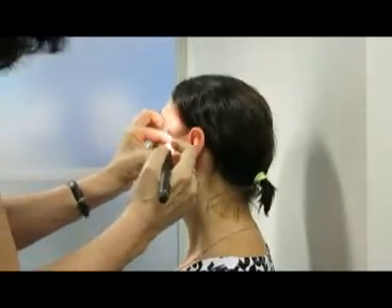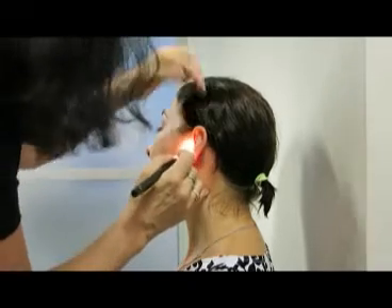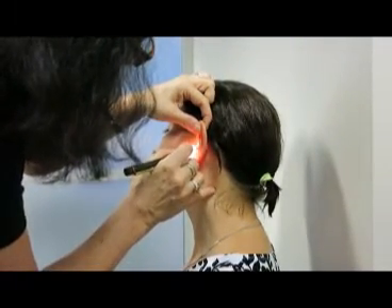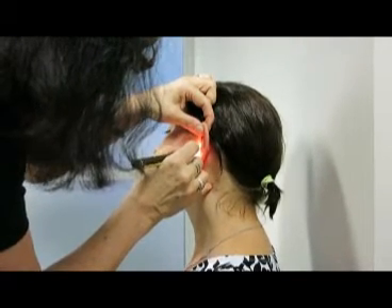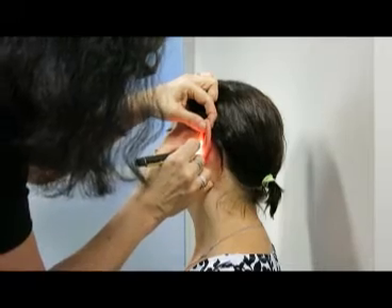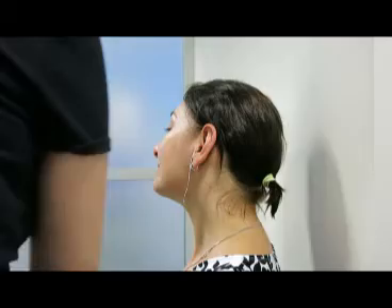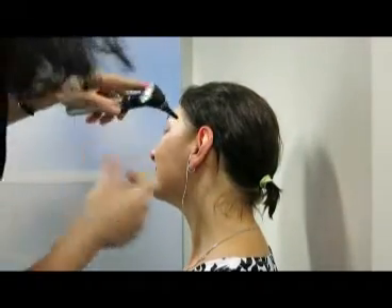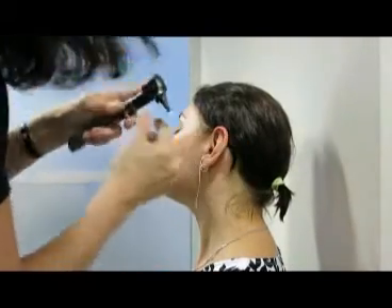Now I'm going to put in the otoblock to block the ear, and I put it in here gently and slowly. Next thing I do is have another look in her ear. It's fine.